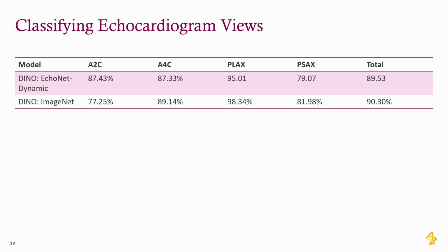I should say, after producing this presentation, we have some preliminary results where we also use these parcels for classification. The idea is that the extent to which different parcels are present in the image should tell us something about which view it is. The preliminary results are really promising. And the good part with parcels is that, once again, they're easily communicated and easily understood by us, but they also have a much lower dimensionality, so they work better with classifiers for that reason as well.